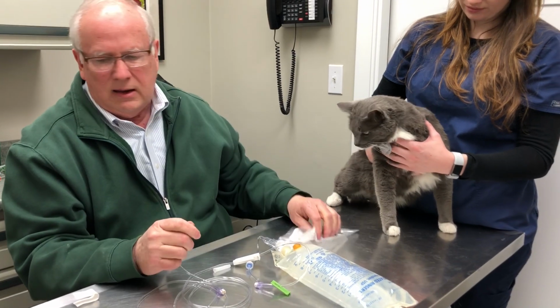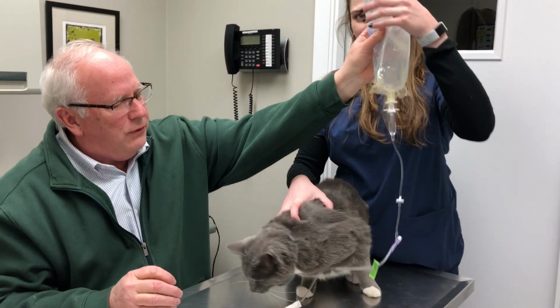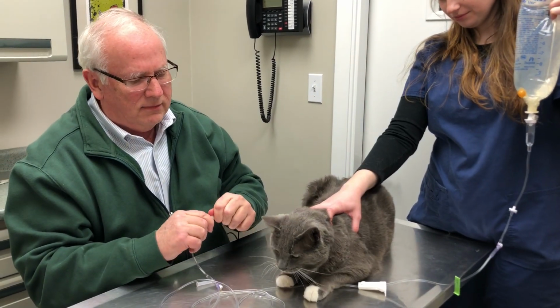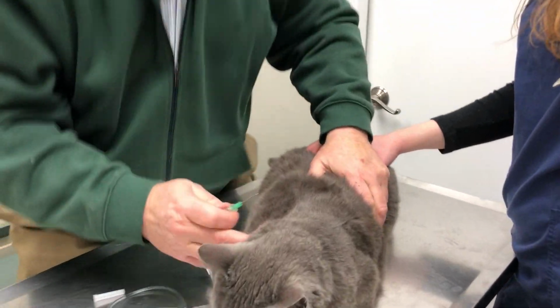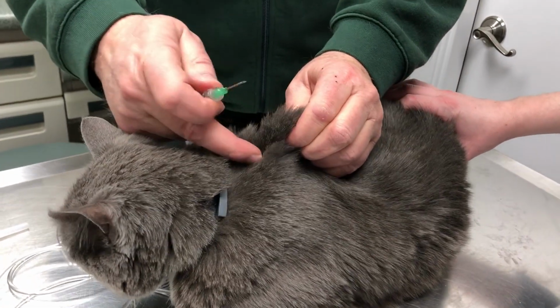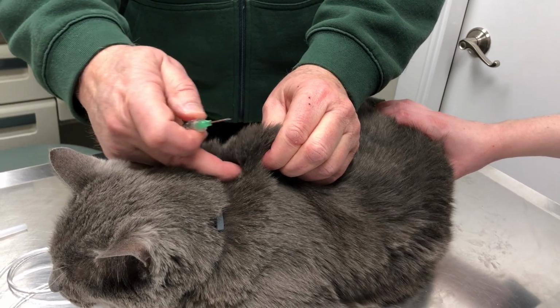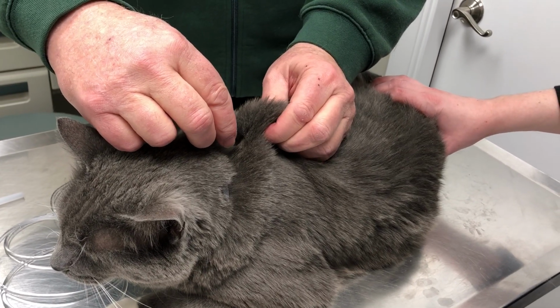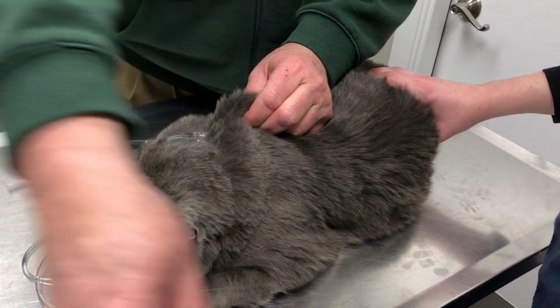So I'm going to have my IV stand here, Kirby, hold the fluids up. And subcutaneous fluids is just like a subcutaneous shot in a cat. We're just going to make a little tent here where we can feel underneath here. We can feel there's just an opening to the skin. We're going to stay at a 45-degree angle and a quick poke. Okay, so that's done. So the injection is done.